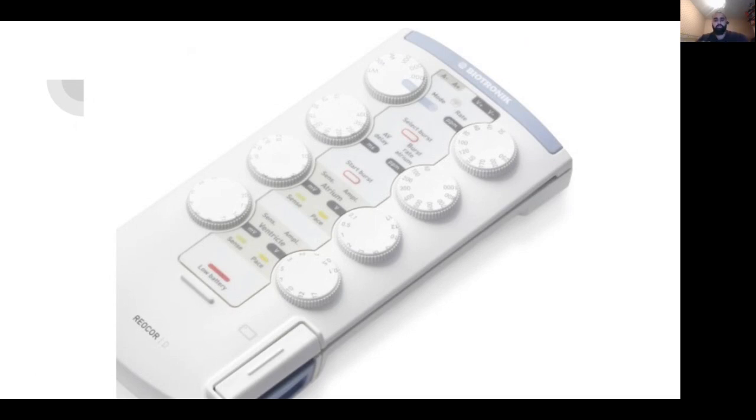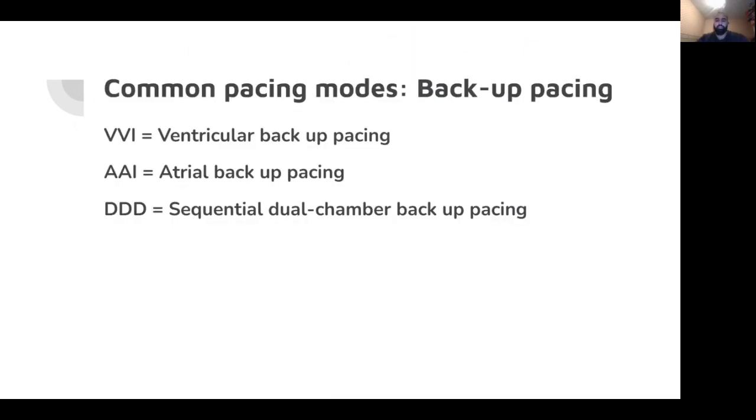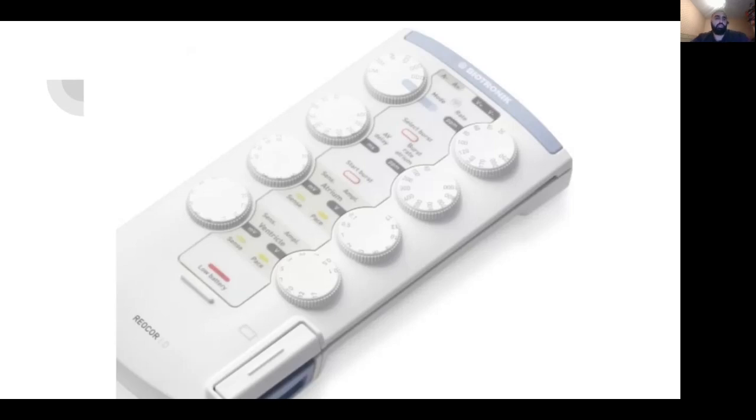Once you have figured out what amount of voltage results in consistent depolarization of the ventricle after a pacing spike, then you can say you have determined the threshold, and you say you have electrical capture. These are the two ways to describe this number. So in practice, you'd say, okay, the threshold for this patient is 3 volts. You might say the ventricular threshold is 3 volts.